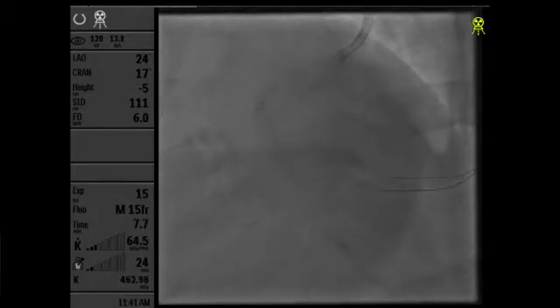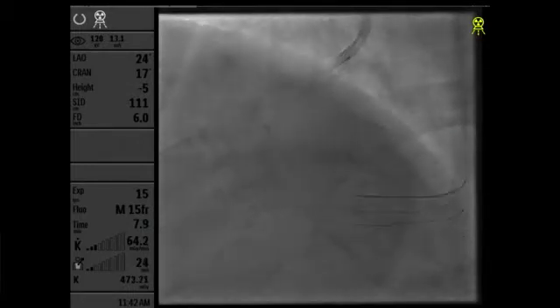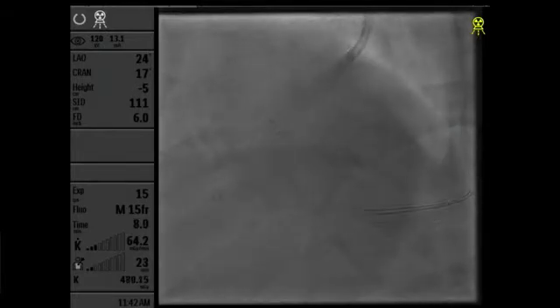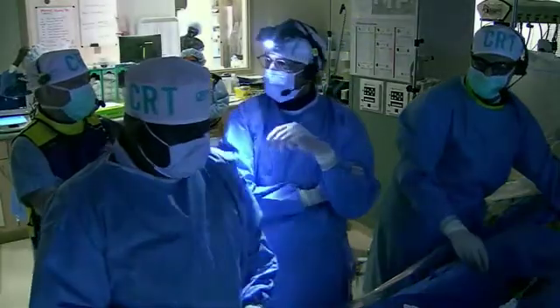Just as a question to the panel. I'm now right at the lesion, I guess, with my guide extension. I'm going to try to bring the IVL balloon now, and then we'll see how that goes. Do you want to ultrasound it now? Or what size balloon did we just use to pre-dilate? 3.0. Do you want to ultrasound it now, or is everyone afraid to see what the ultrasound is? No, no, I just don't know about IVUS. It's just OCT.